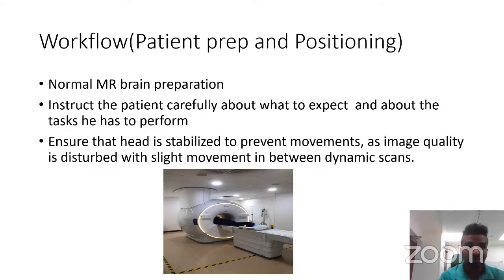So at a point of time when we want to acquire the specific activation of a specific activity you do, you should not get engaged with any other activity. When we say start, you just start doing the activity. And when we say relax, just stop doing it, and make your mind and everything else void. Along with that, ensure that the head is stabilized to prevent movement, as already told, to get proper images without any movement artifact for better temporal resolution.